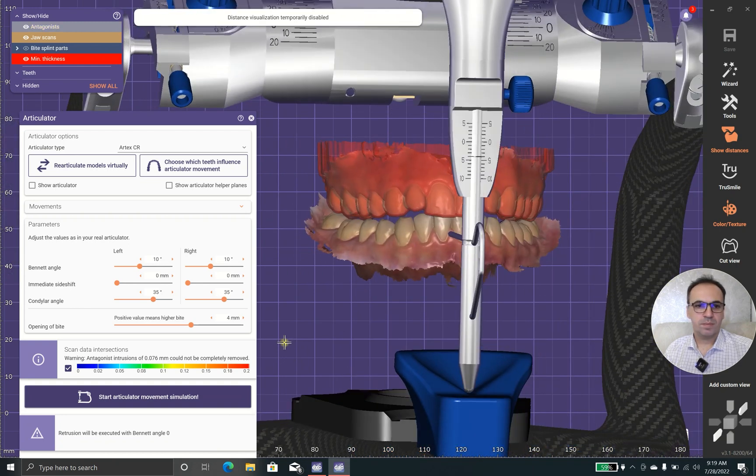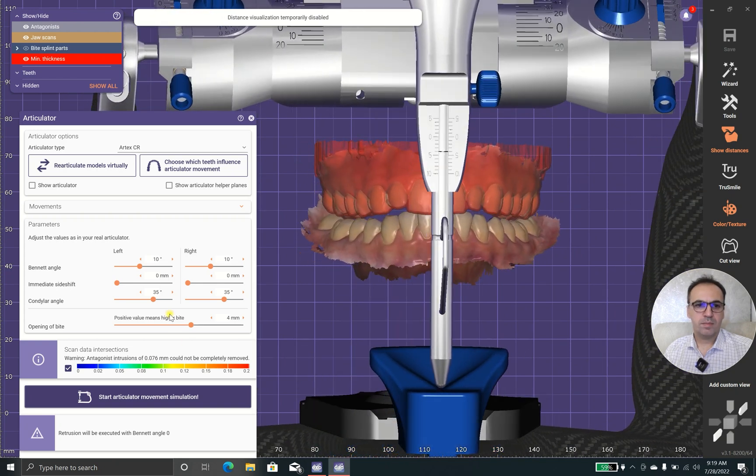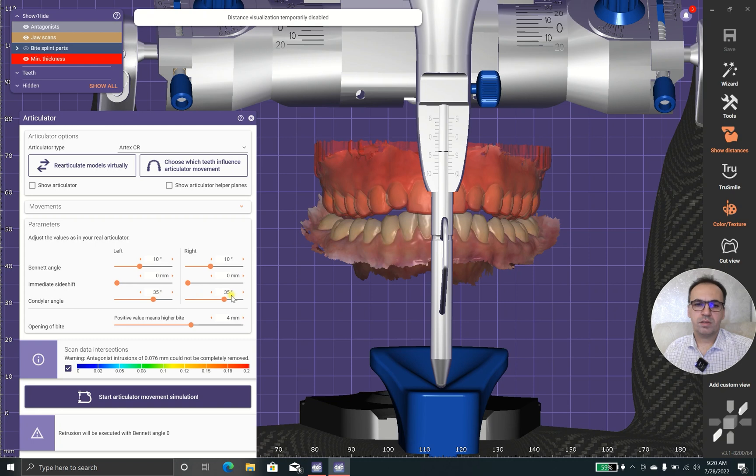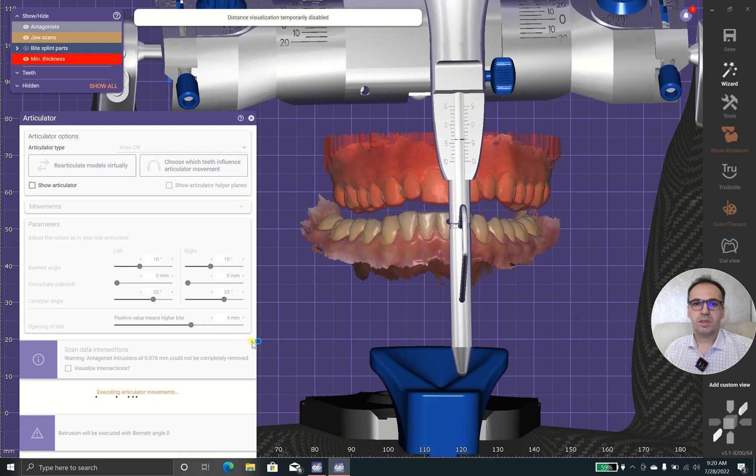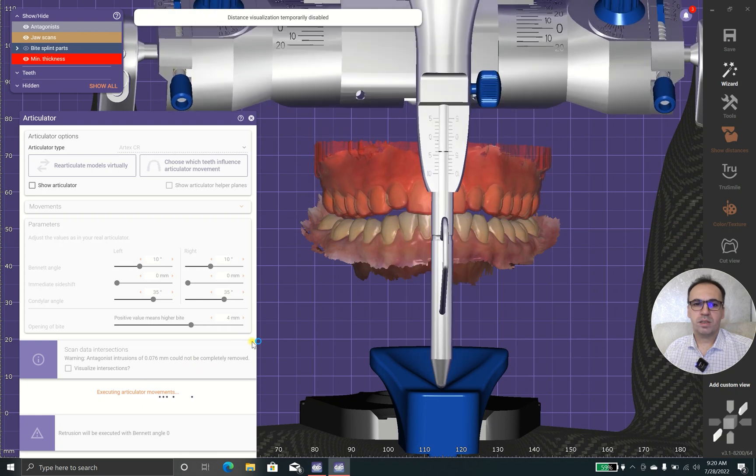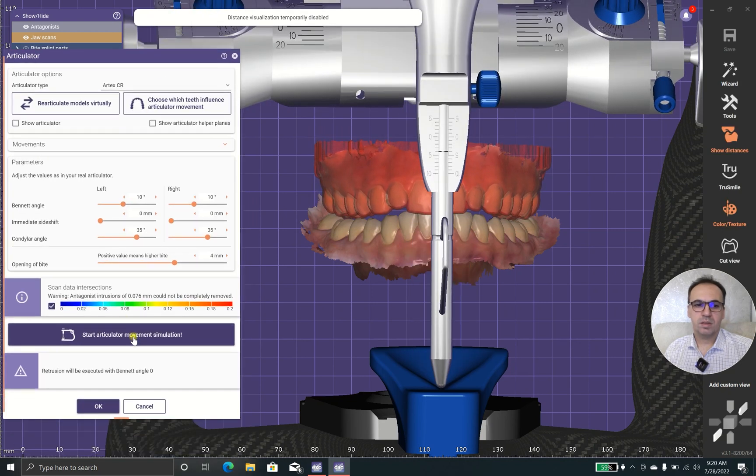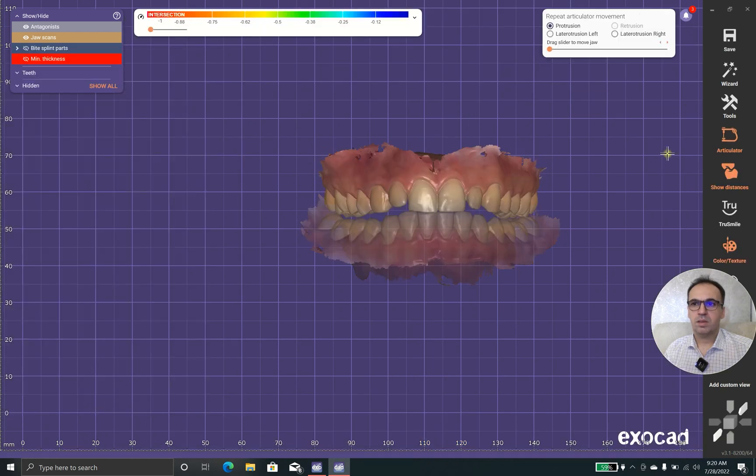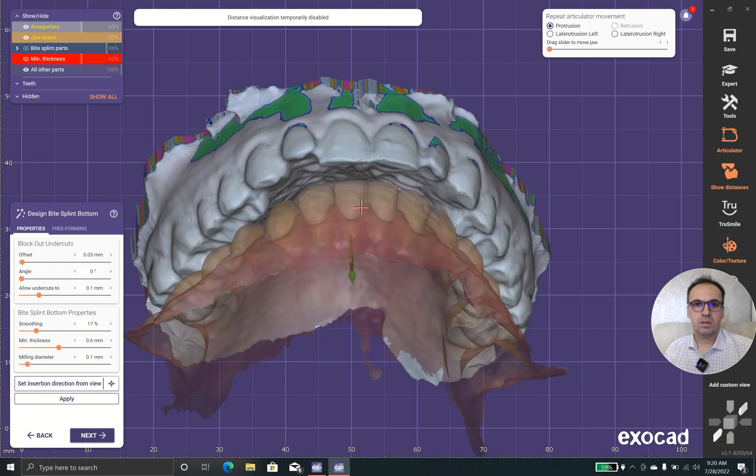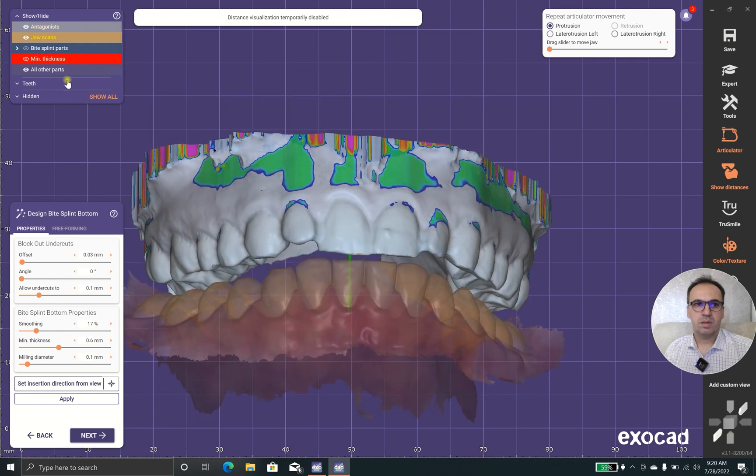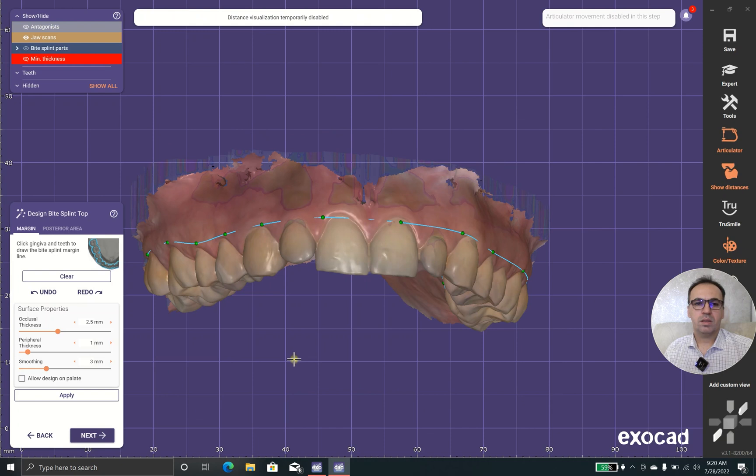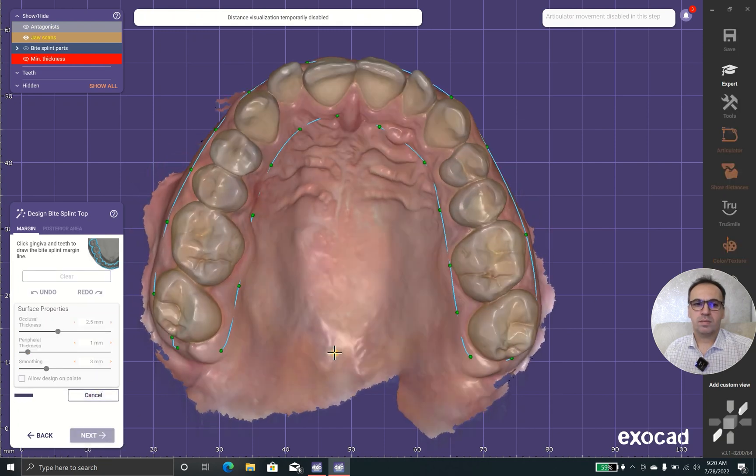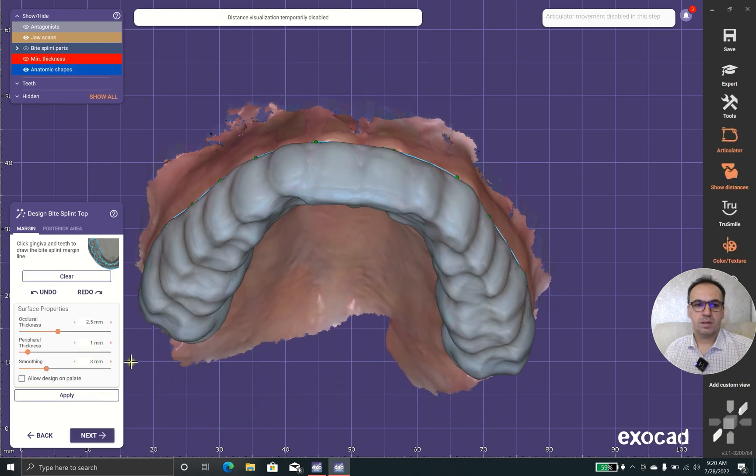This looks good. Condylar 35 degrees, 10 degrees Bennett angle, shift zero. I'm happy with these settings, and I'll run the articulator. Now I'm going to design my splint.